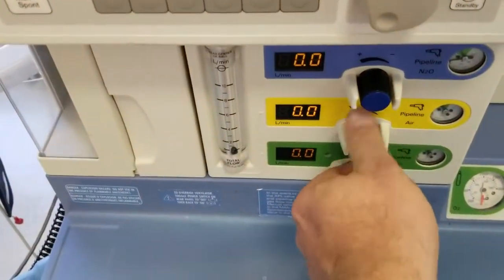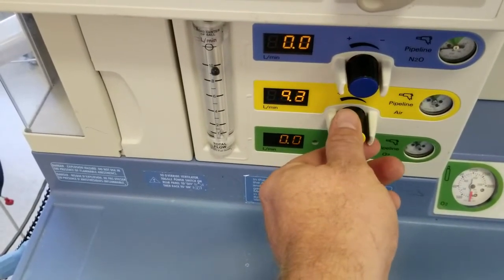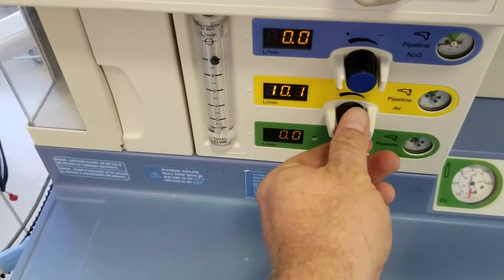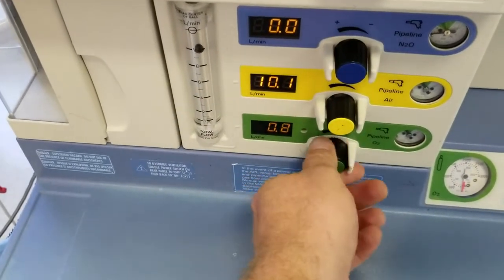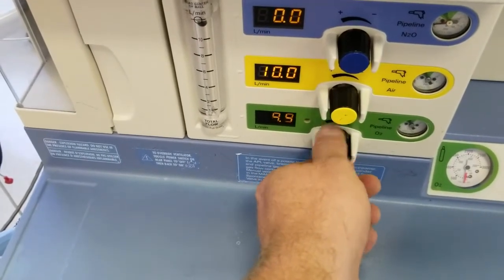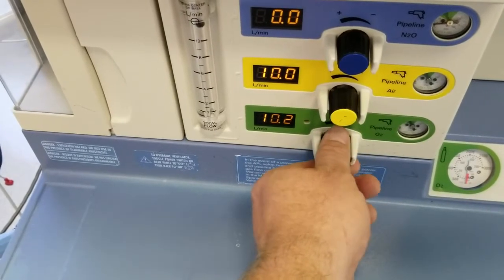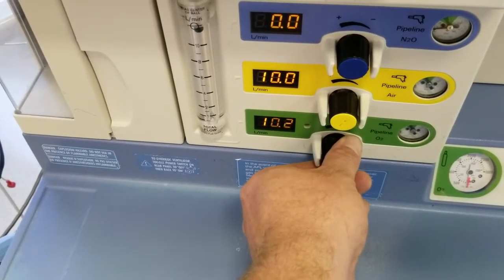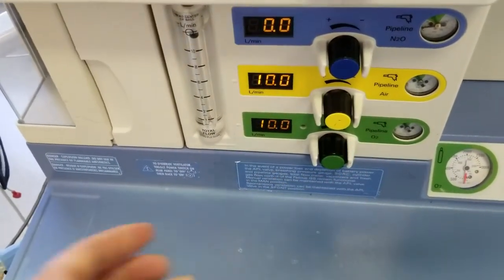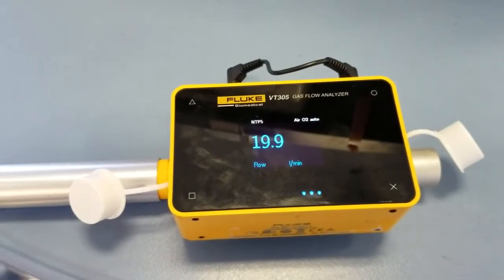We're going to turn our air to 10 and our oxygen to 10, so it's giving us a total of 20 liters a minute. On our meter you can see we now have 20 liters a minute.